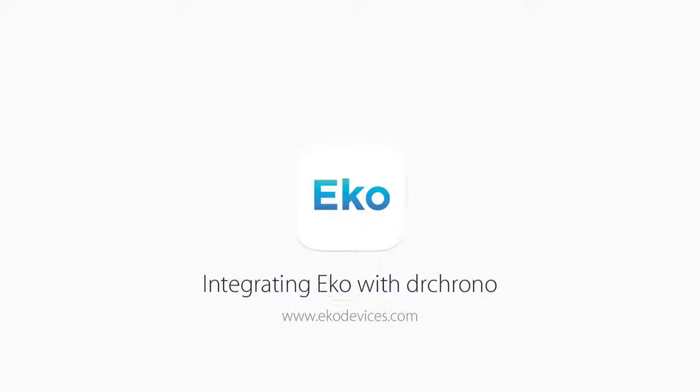This video will demonstrate how to integrate your drchrono account with the Eko mobile application and web dashboard.